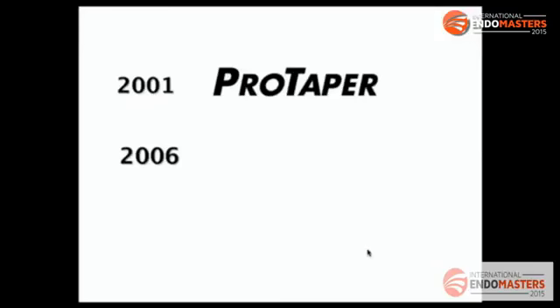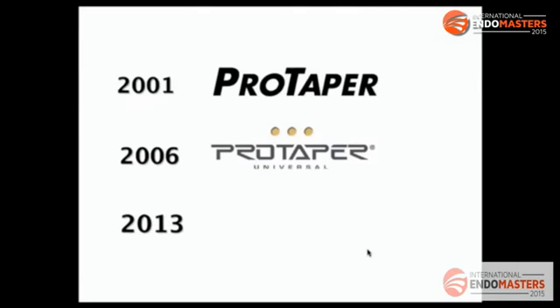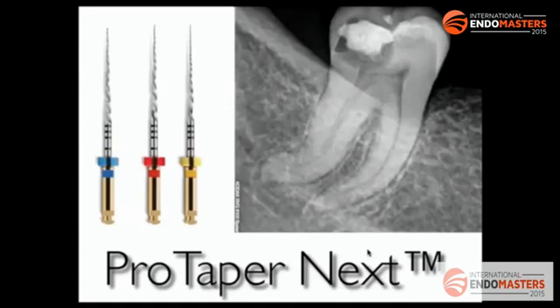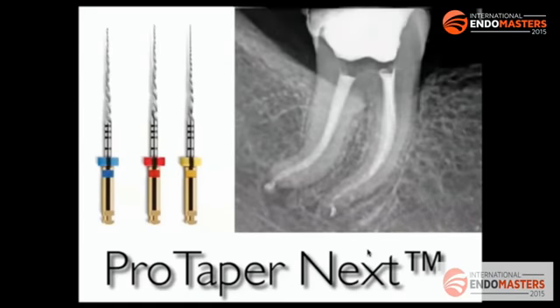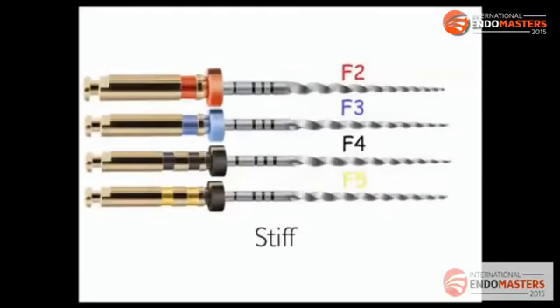Okay, now let's talk about ProTaper Next. In 2001, we got ProTaper. In 2006, we got ProTaper Universal, with some changes. And in 2013, we got ProTaper Next. ProTaper Next is a nice system. We can shape all kinds of canals, small and big canals. We can go to tip 25, we can go to 40, to 50. So it's a really useful instrument. We can use it in all cases, really small cases, wide cases, all kinds of cases.